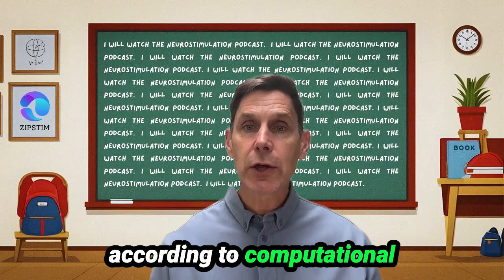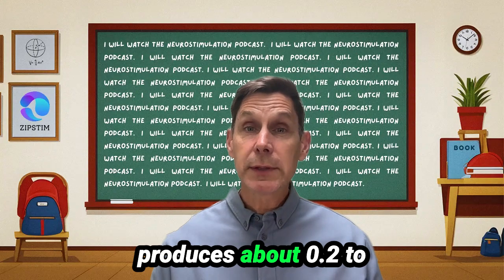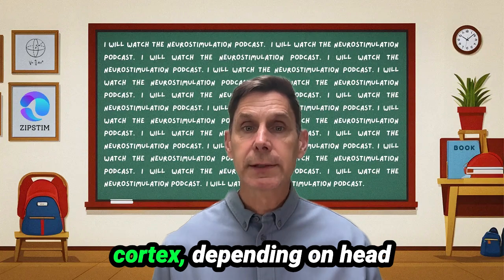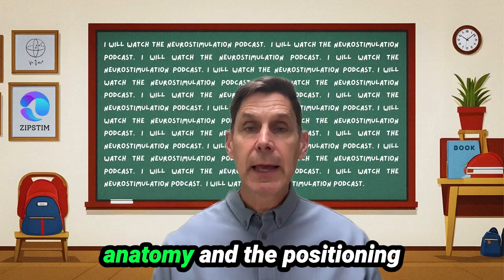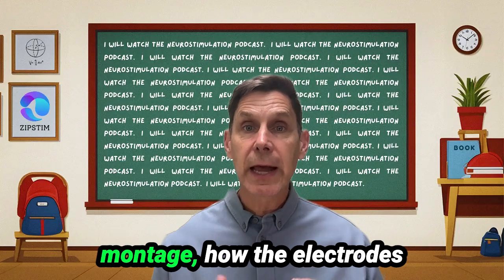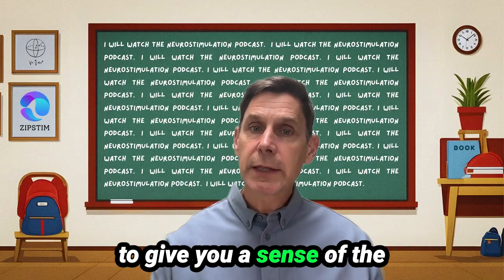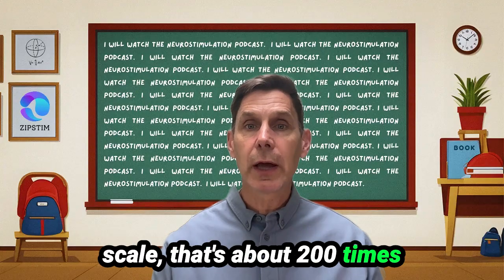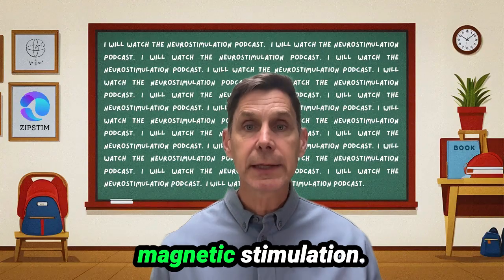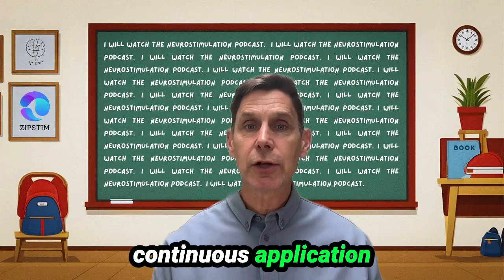According to computational modeling studies, 1 milliampere of current produces about 0.2 to 0.5 volts per meter in the cortex, depending on head anatomy and the positioning of the electrodes, which is technically referred to as the montage, how the electrodes are situated on the scalp. To give you a sense of the scale, that's about 200 times weaker than the electrical field induced by transcranial magnetic stimulation. But with tDCS, it's a continuous application of energy.